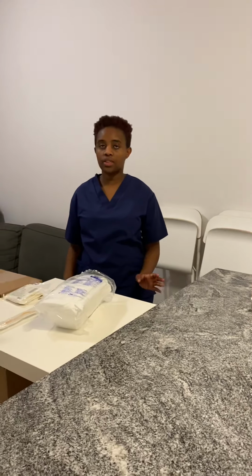Before I perform catheterization, I have to make sure that I check the physician order and the agency policy. And then I'm going to introduce myself to the client, provide privacy, explain the procedure to my client, and obtain consent from the client. After I get consent from my client, I can go ahead and do my pericare.